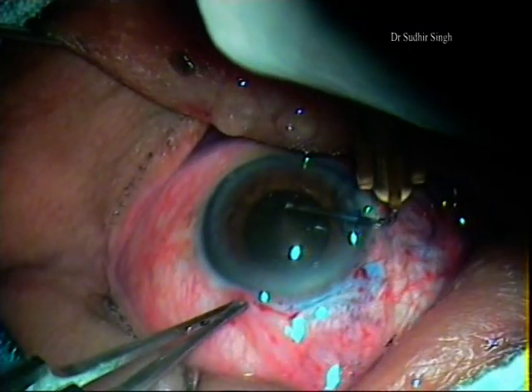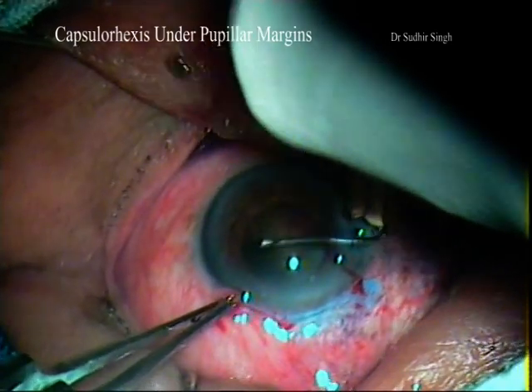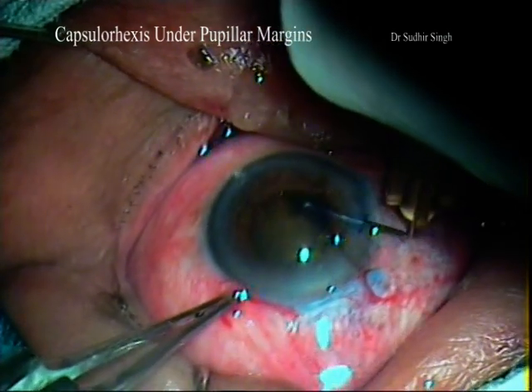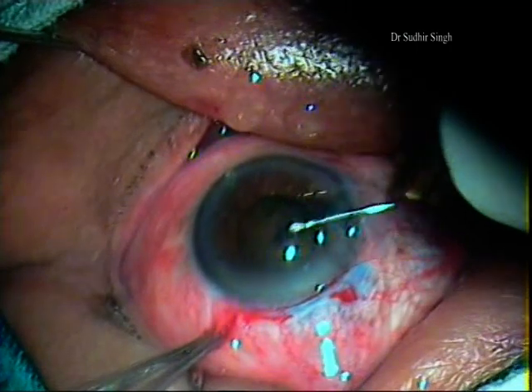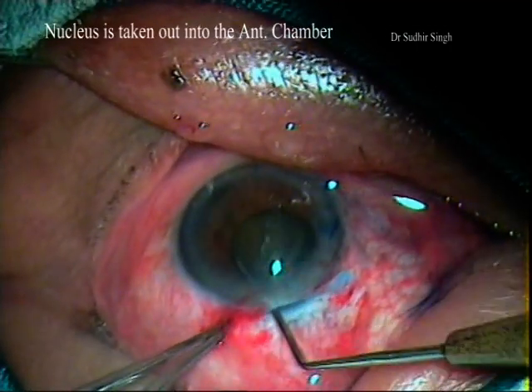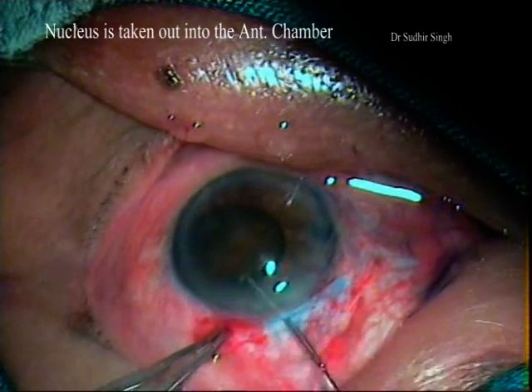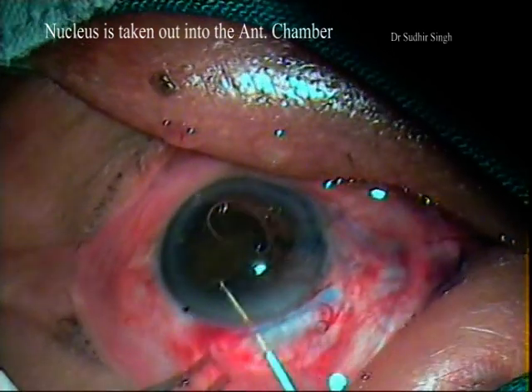In this case, pupil size is about five millimeters, so capsulorhexis is attempted under the pupillary margins. Capsulorhexis is successfully done; if not, we would have converted to can opener capsulotomy. After hydrodissection, the nucleus is rotated and taken out into the anterior chamber by Sinskey hook. Two to three relaxing incisions may be given at capsulorhexis margins if the nucleus is anticipated to be large.